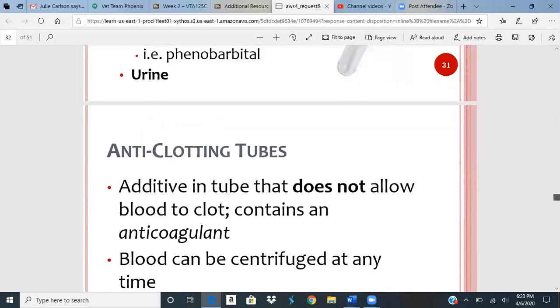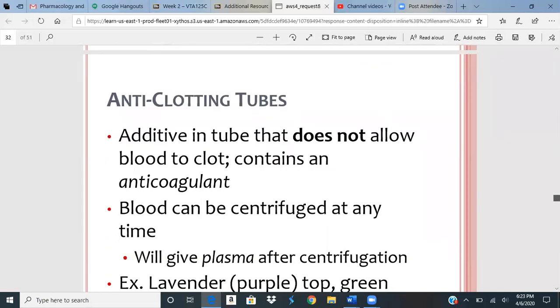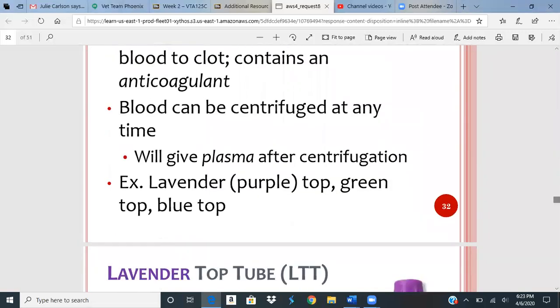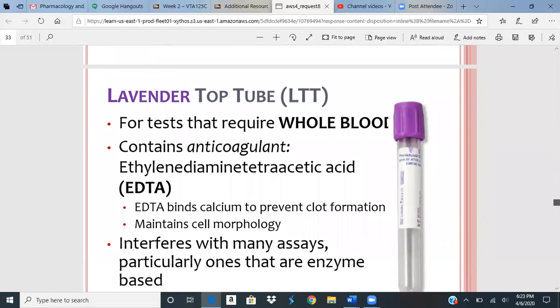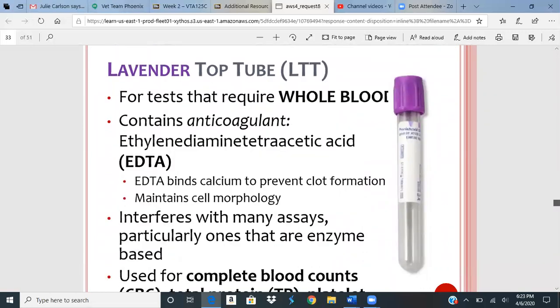Okay. Then anti-clotting tubes. So blood's not going to clot in these. They have some kind of anticoagulant in them. So the lavender top tube is the one used most. There's also green and blue. Lavender, I'd say we use the most in practice. When we need a whole blood test, we want to run like a CBC, we'll take a purple top tube. It's got EDTA in it, which is ethylene diamine tetraacetic acid. So that's going to bind to calcium, and that's going to make it so the blood doesn't clot. So it stays in that tube.